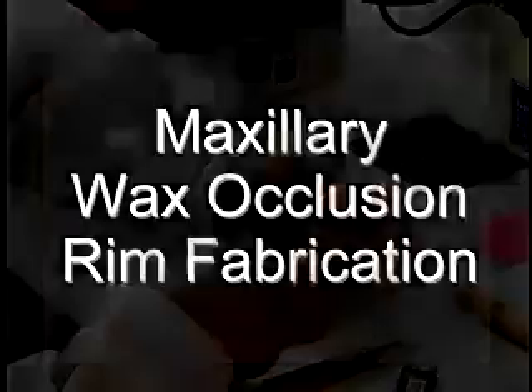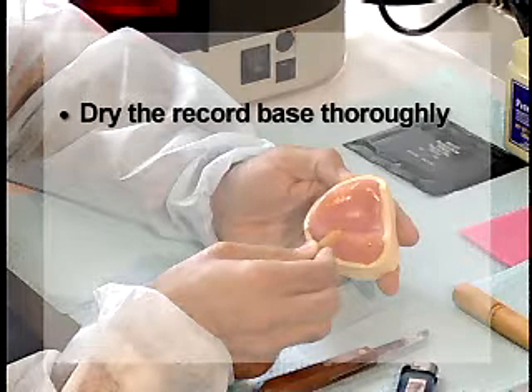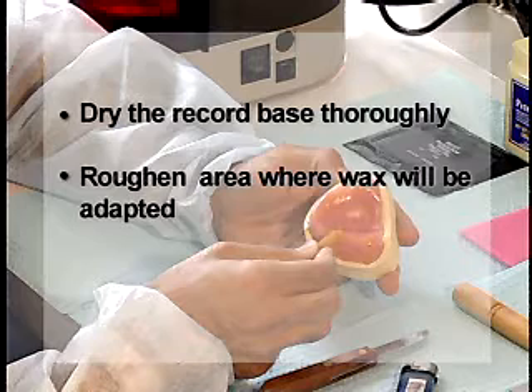Dry the record base thoroughly, as wax will not adhere to a wet surface. Roughen the area of the record base where the wax will be adapted.